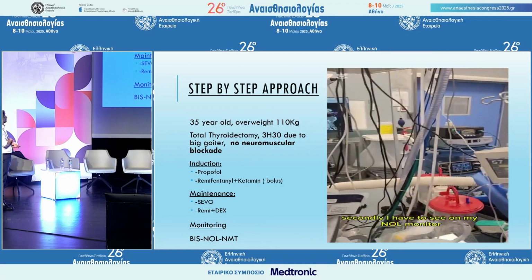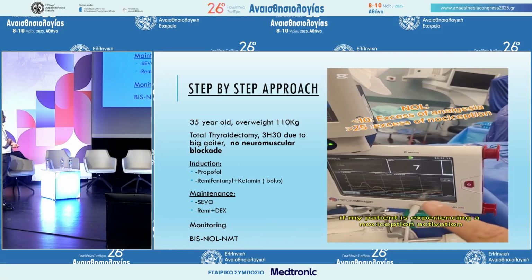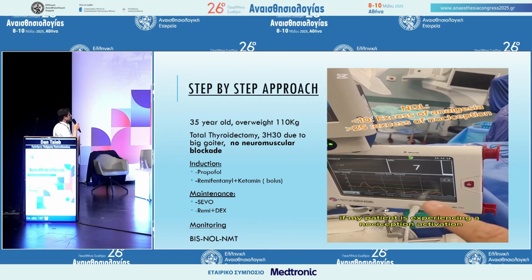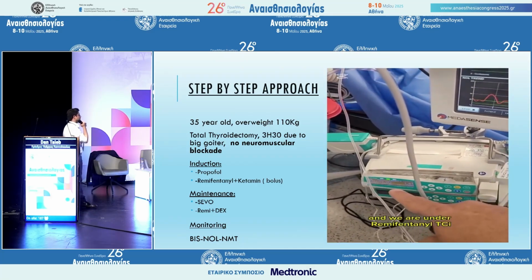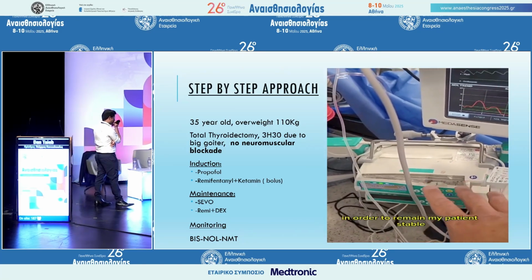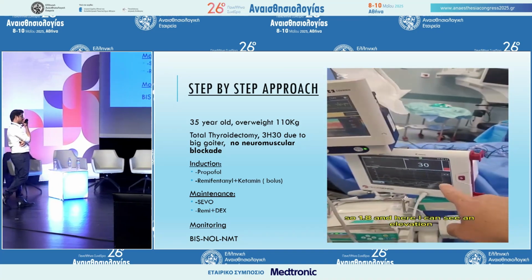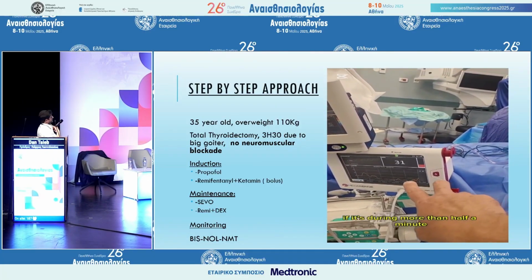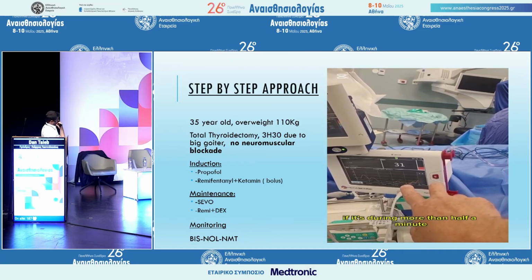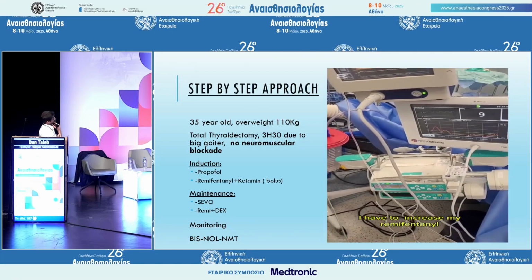Secondly, I have to see on my NOL monitor if my patient, just to remind you, is between 10 and 25. Above that, he's experiencing a nociception activation, and we are under remifentanil in order to keep my patient stable all along the surgery. So 1.8, and here I can see an elevation. If it's lasting more than half a minute, I have to increase my remifentanil.